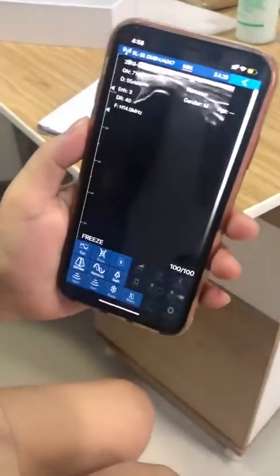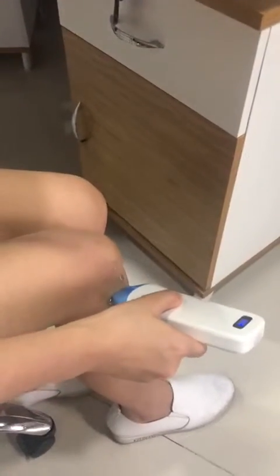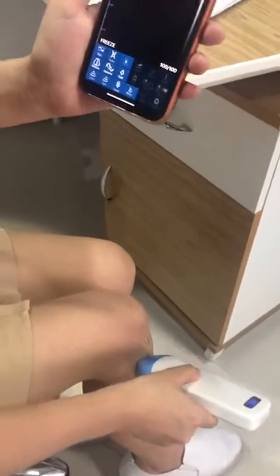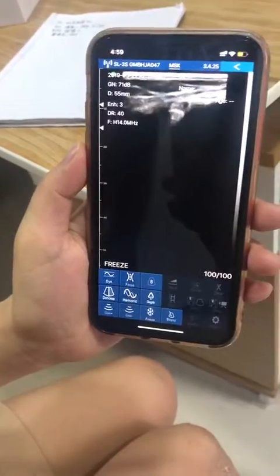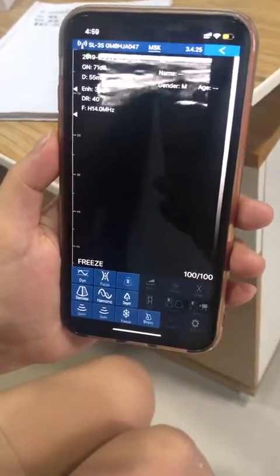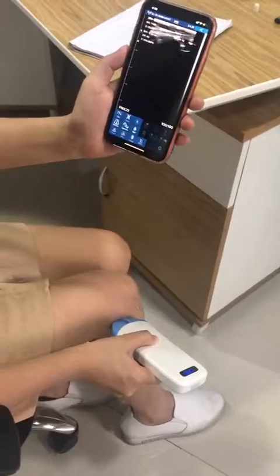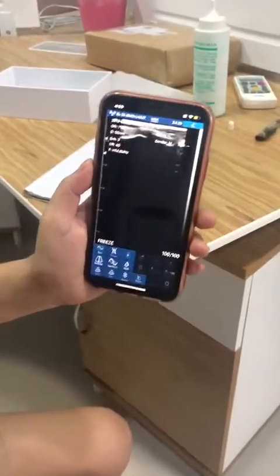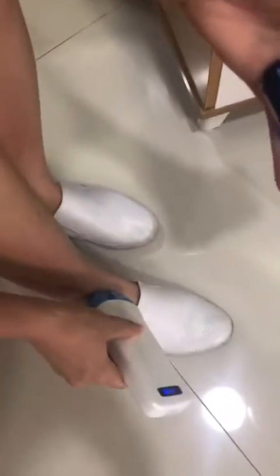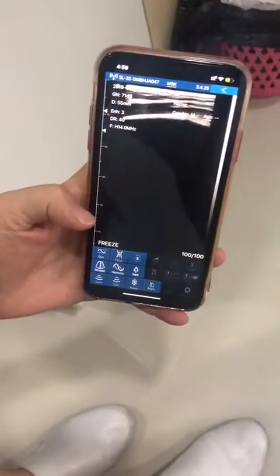Move, move, move — yeah, you can see it's good. Move to the release to the muscle, yeah, muscle also, yeah. Okay, I think it's great. And then to the ankle, okay. You can see, yeah, really very good, it's clear.